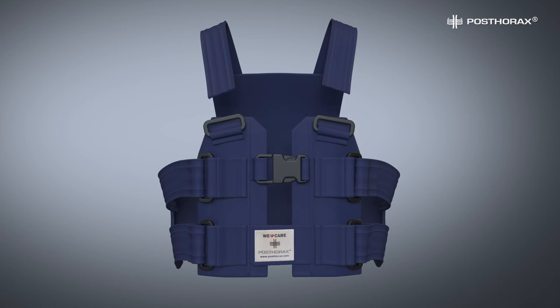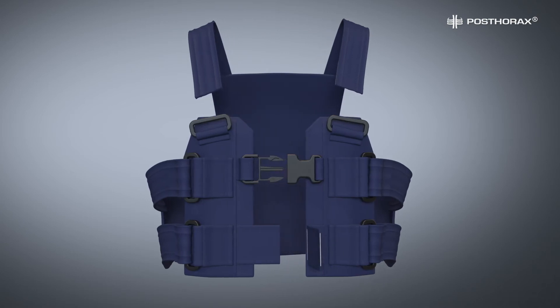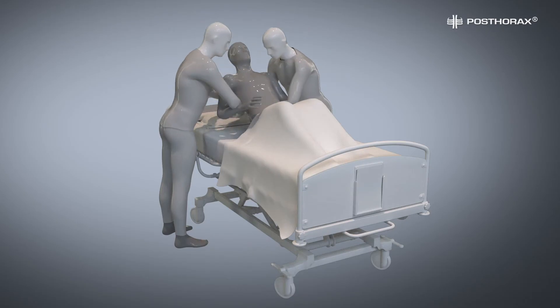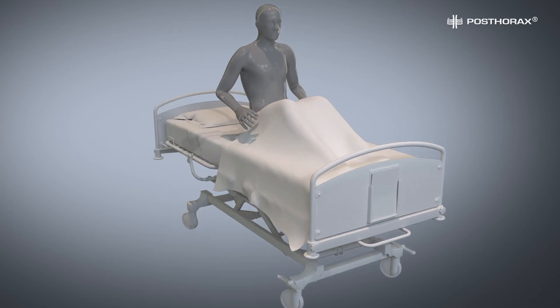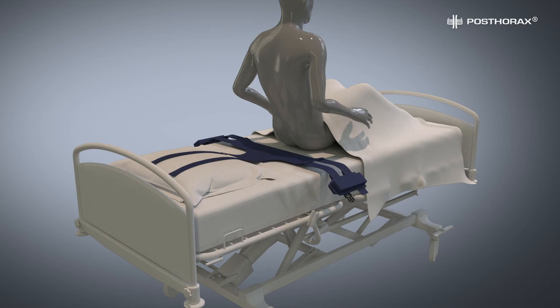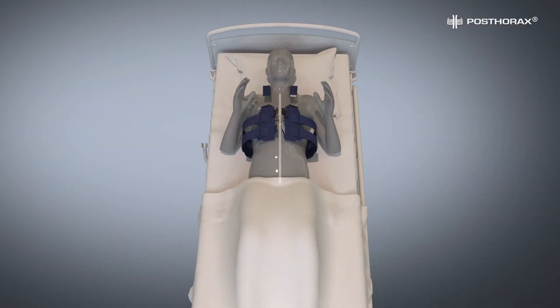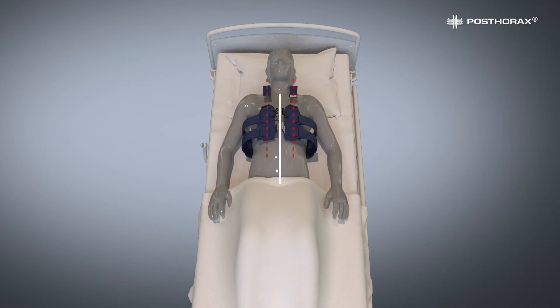Open both shoulder straps, front buckle, and Velcro closure. Lift the patient's back again and place the open Postorix vest flat onto the bed, in a position low enough where it meets the patient's lower back once he is placed back in reclining position on the vest. Make sure the spine is centered between the shoulder straps.